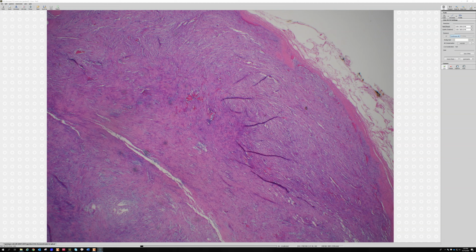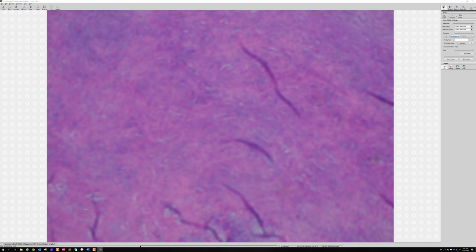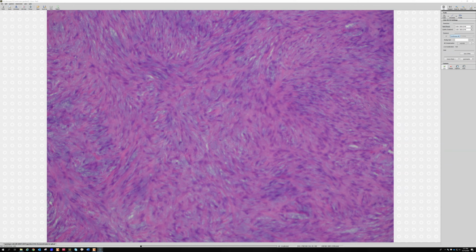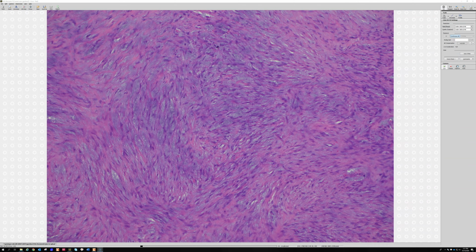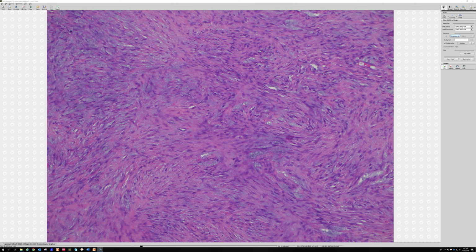Okay. It's like an encapsulated nodule with lots of a tissue culture appearance, like a spindle cell growth, fibroblast. Yeah. Which is suggestive, especially the clinical course, suggestive of nodular fasciitis. Yeah, that clinical history of a rapidly growing but relatively small lesion, often on the extremities of a young adult, although it can occur in kids, it can occur in old patients, it can sometimes be on the head and neck. Those are always, though, a good history for nodular fasciitis or other related entities.